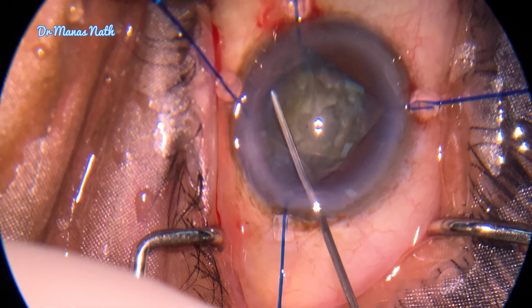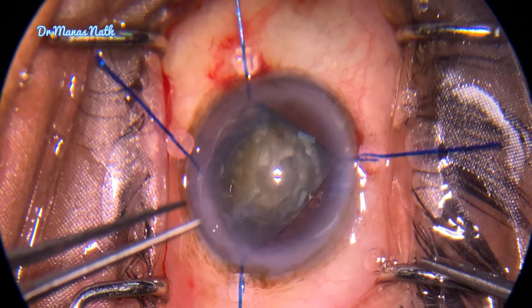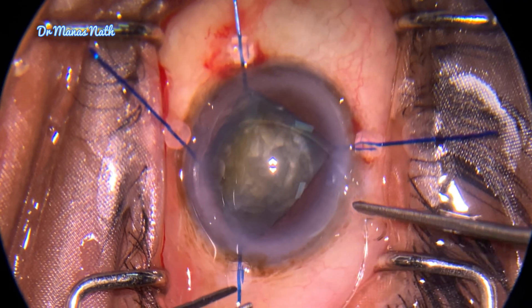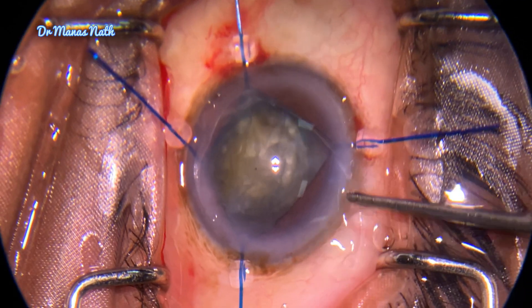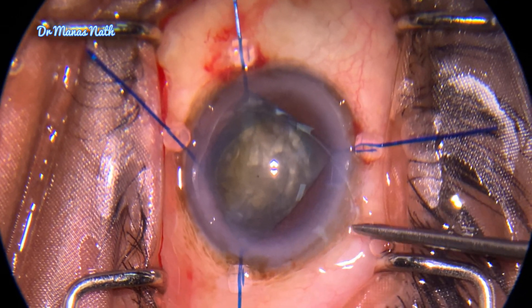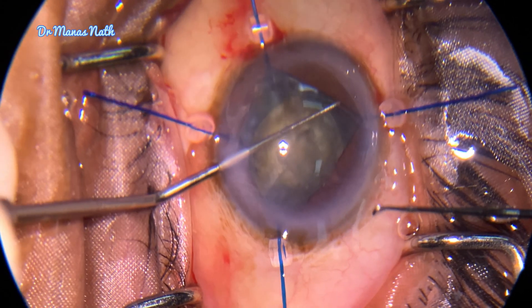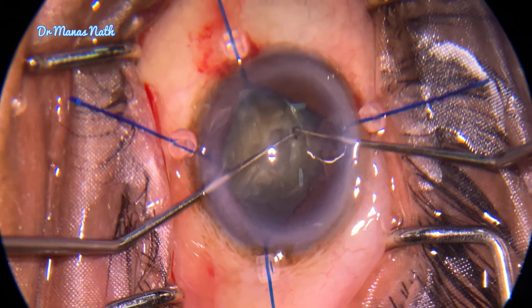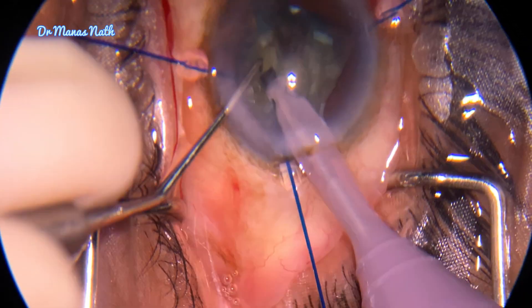I injected viscoelastic just below the rhexis margin to create space for the passage of a CTR, because with generalized weakness of zonules, a CTR will definitely help — it will provide equatorial support. The leading arm has gone inside the capsular bag, followed by the trailing arm. I'm using two Sinskey hooks, and now the CTR is seated.